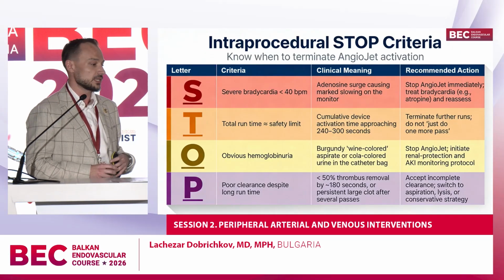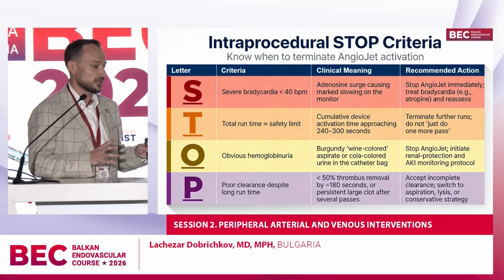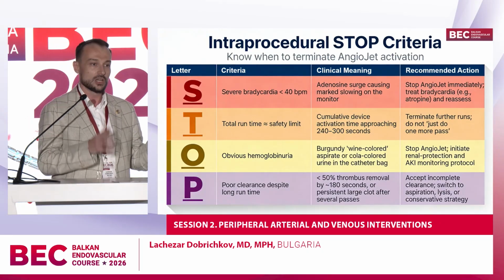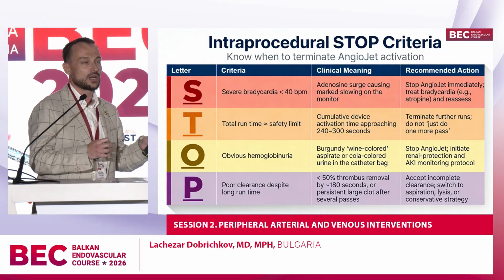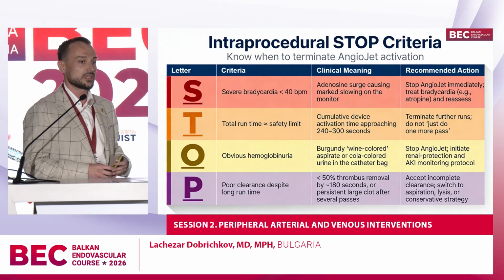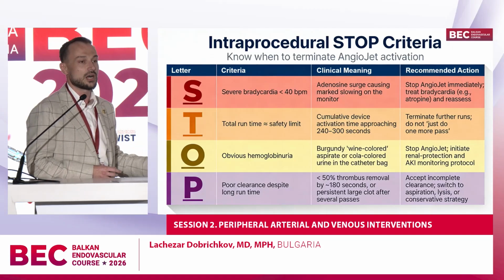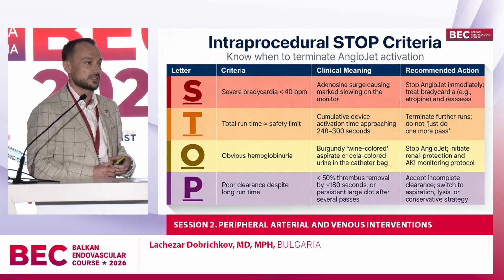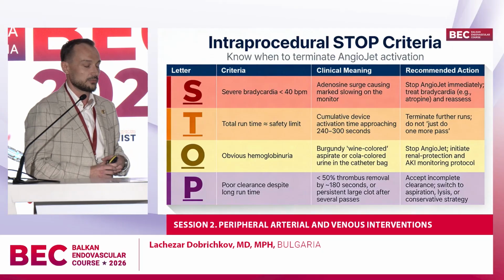So this is easy to memorize. My concept for the definite stop criteria, when we should stop the procedure, wait for a while or a bit longer, and after that proceed, or sometimes we should terminate the procedure and think of another option for revascularization, or if it's feasible, continue the procedure on another day if the patient is not in limb-threatening ischemia.